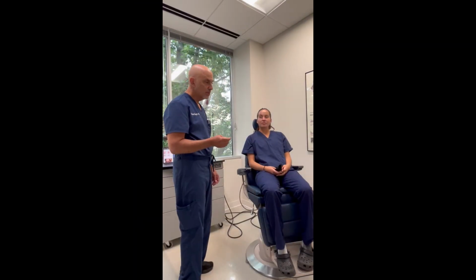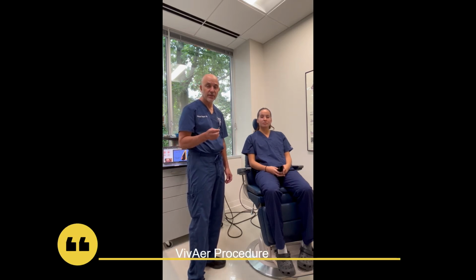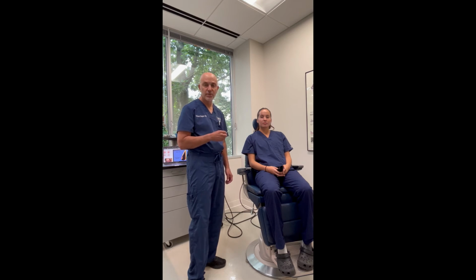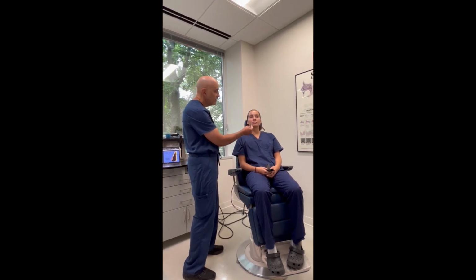What we're talking about now is the VivAer procedure, and what it does is it uses radiofrequency to reshape the upper lateral cartilage. We do that generally as an office procedure, and we first put some anesthetic on a piece of cotton in the nose. We leave it sit for a little while, and it makes it anesthetized so that when we inject a little bit of anesthesia, you don't really feel it.